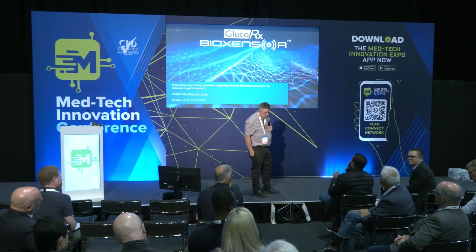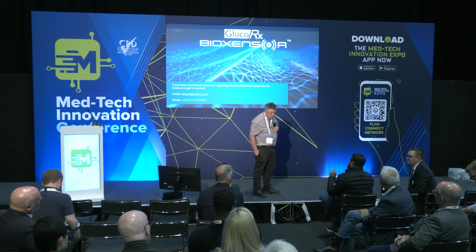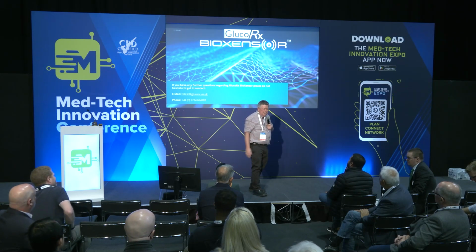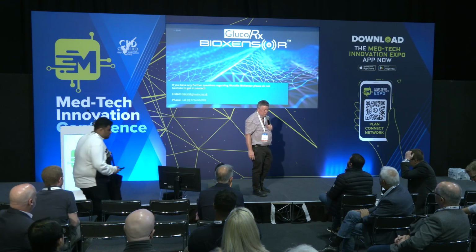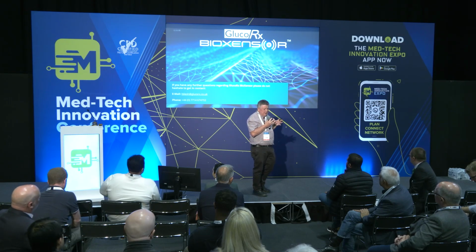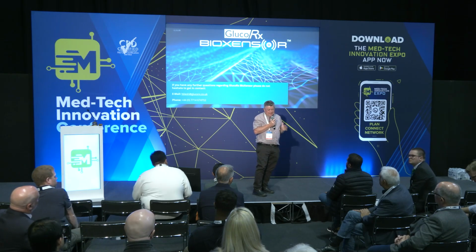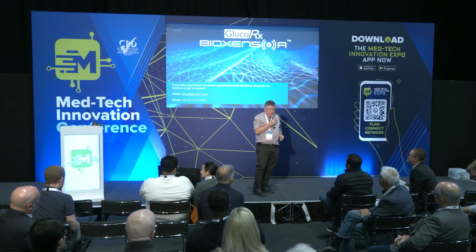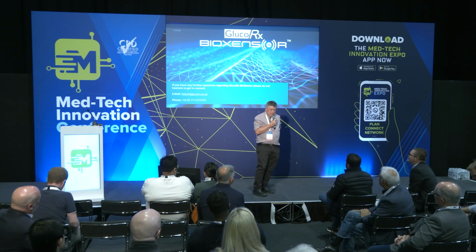One is regarding, you said there is a 15 minute delay for the FreeStyle Libre. What's the delay in your device? Good question. I didn't actually state it explicitly, but we don't see any delay. We see an instantaneous change because we are averaging interstitial fluid and blood, so there's probably a mix of the two, but the rate of change is exactly the same trigger of glucose in blood as what we see in the venous blood. So we don't actually see a delay, which is one of the important features of having a non-invasive sensor that looks at blood.